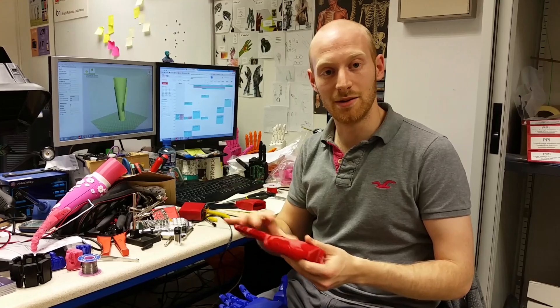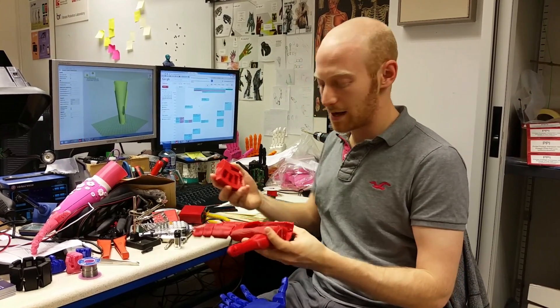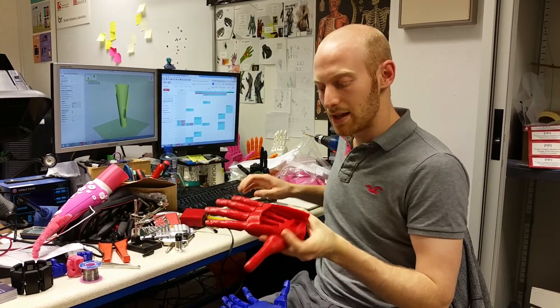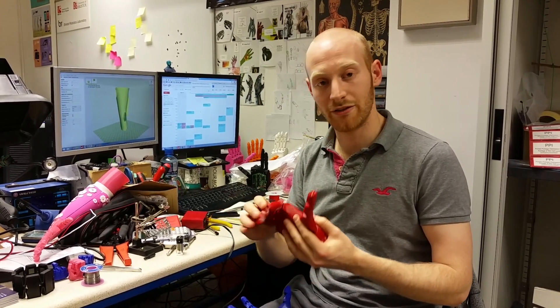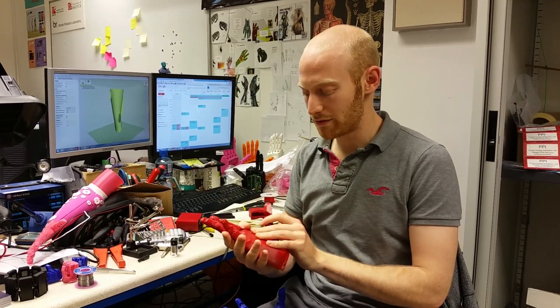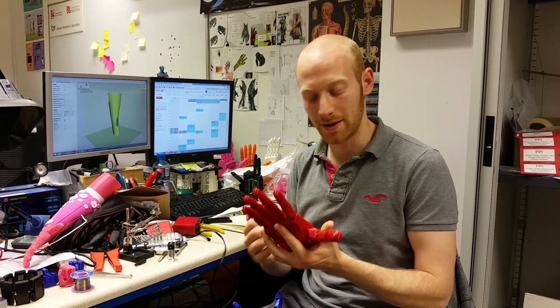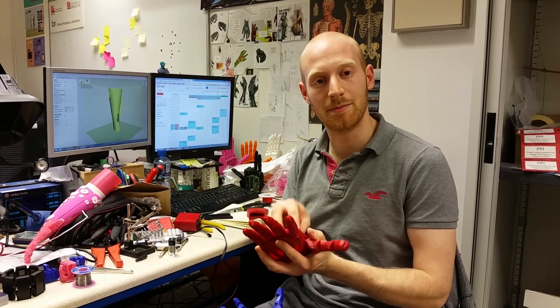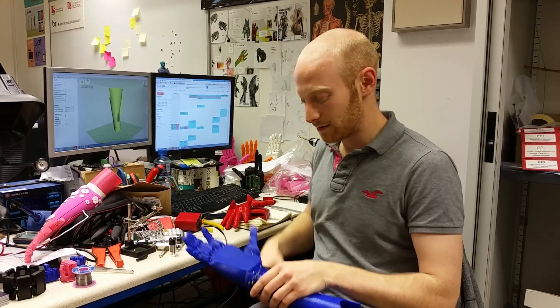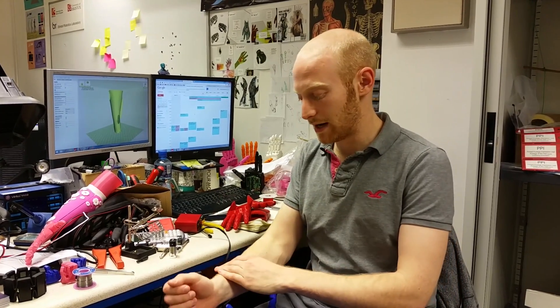The way it works is that we 3D print the hand in one piece or a couple of pieces — a lid and a palm — and the palm is a puppet. All of the joints are flexible, the fingers can move, and we thread wires through them. Actuators then pull the strings like a puppet, enabling us to fit all the mechanical components inside the palm of the hand.